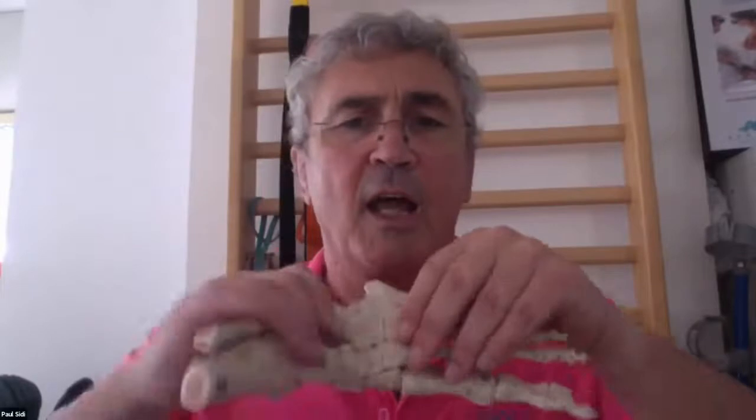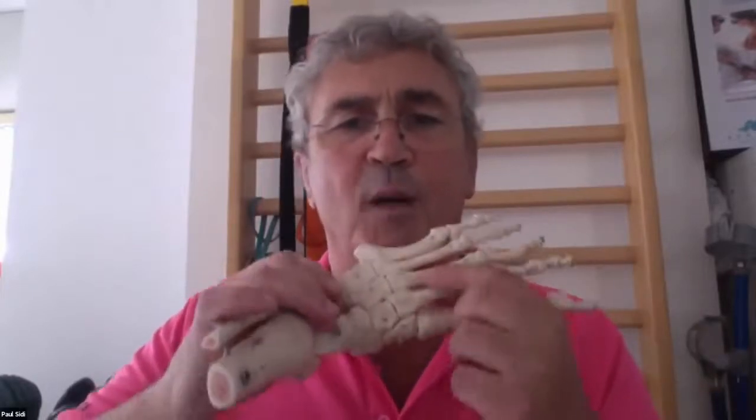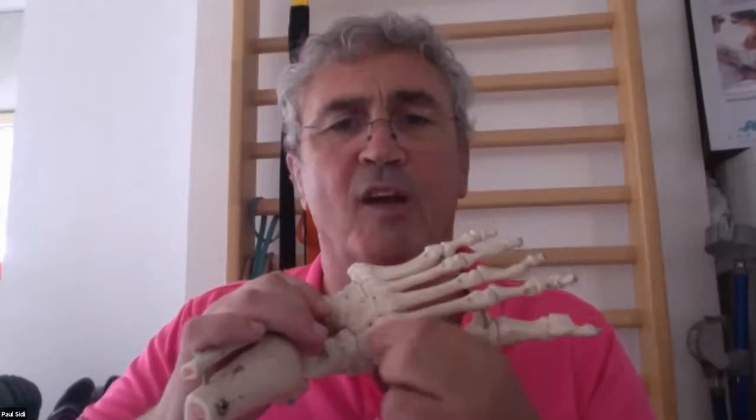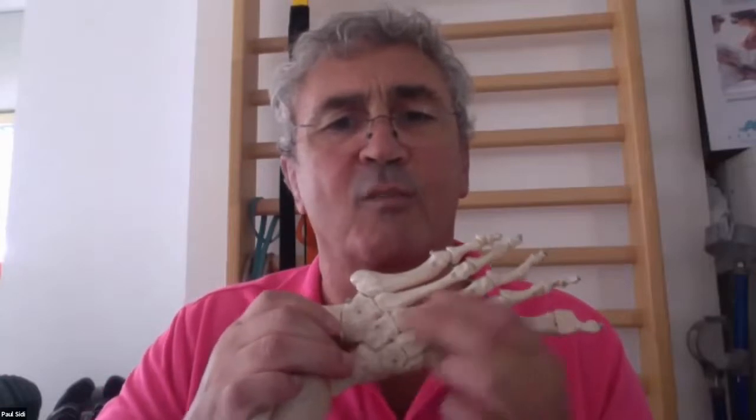because what you've got to do is look for the optical window. Now, when I'm talking about the optical window, the biggest problem on the foot here is going to be on the dorsal aspect of the foot. This is where the problem generally is. And we want to get into these joints. It's a fairly rigid area, this. It doesn't move very well.